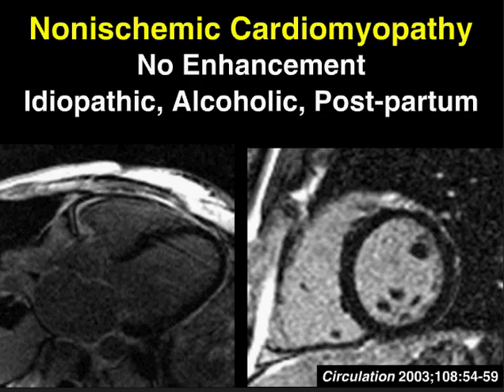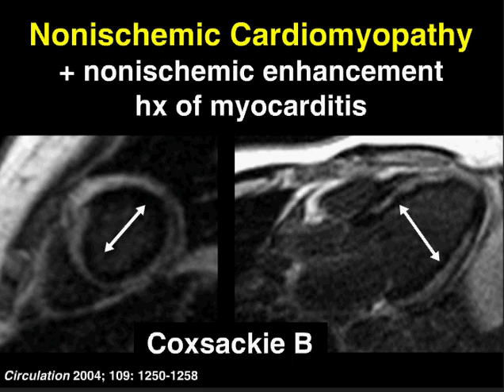Non-ischemic dilated cardiomyopathies that don't enhance at all include idiopathic cardiomyopathy, alcoholic cardiomyopathy, and postpartum cardiomyopathy. Those non-ischemic dilated cardiomyopathies that do enhance generally have a history suggestive of prior myocarditis — as seen in this patient with a history of Coxsackie B myocarditis, in which you get subendocardial sparing but extensive mid-myocardial enhancement.